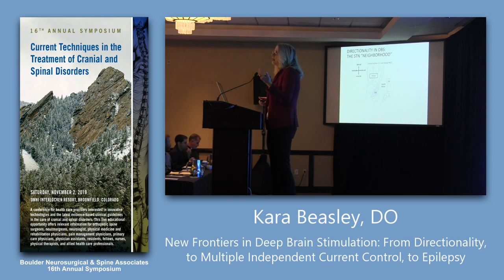And so when I talk about the structure, the STN, that gray structure that you see in front of us, is the structure that we're concerned about stimulating. And just lateral to it is the capsula interna. So that will cause a side effect of tugging, tightness, or pulling. People's faces or body will pull. Just below it is the medial lemniscus. You can get eye deviation. If you're too medial, you get eye deviation and speech slurring. If you're too anterior, you get this uncomfortable feeling, they sweat and they turn red and they just don't feel well. And if it's too posterior, they get this tingling that they can't tolerate in their body.